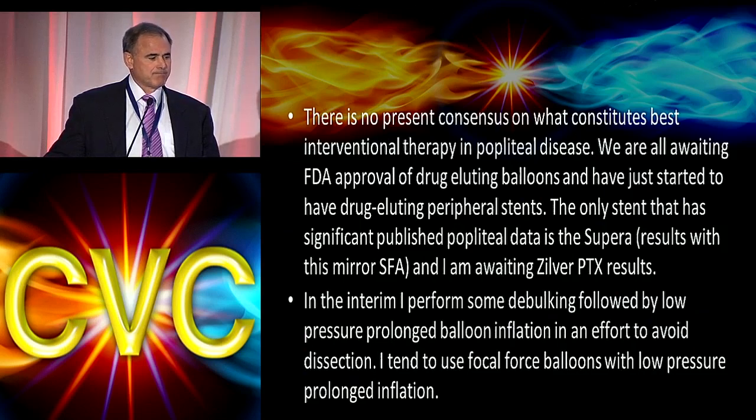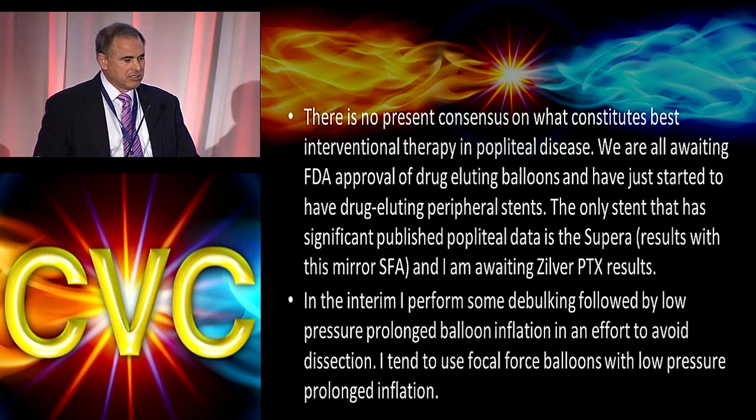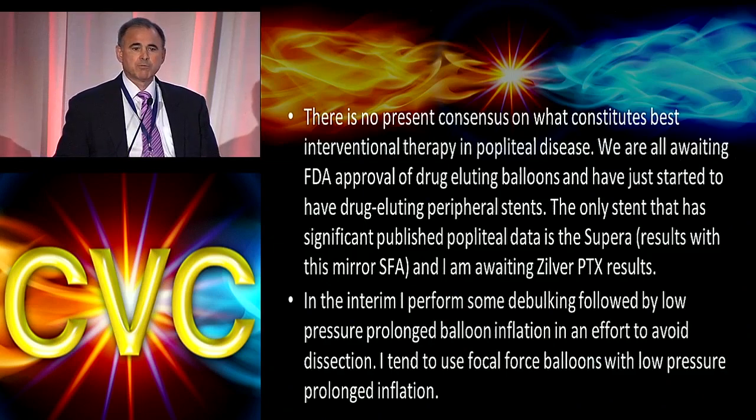In the interim, I personally perform some debulking, followed by low-pressure prolonged balloon inflation in an effort to avoid dissection. I tend to use focal force balloons with low-pressure prolonged inflation, as they have been shown to lessen the rates of dissection and to give a bigger initial lumen. We have no restenosis data, though. Thank you very much for your attention.